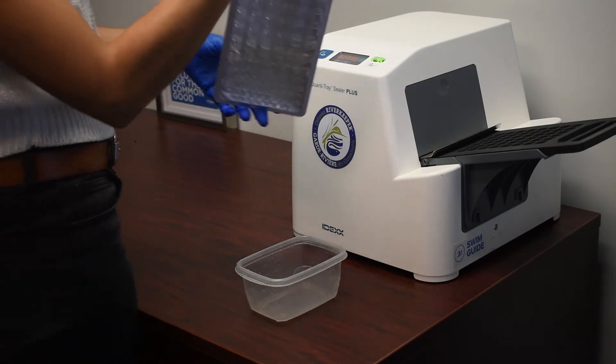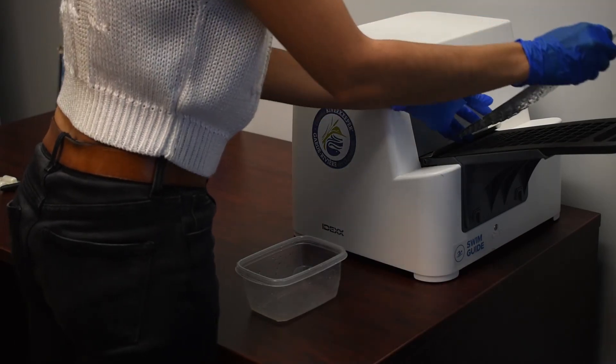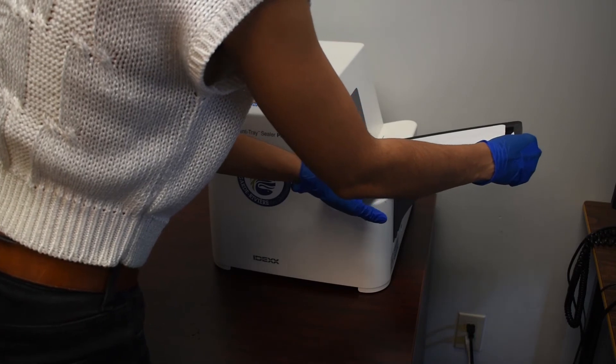Once the sample has been put into the tray, we align it in the tray holder and then send it through our quantity tray sealer to seal the sample.